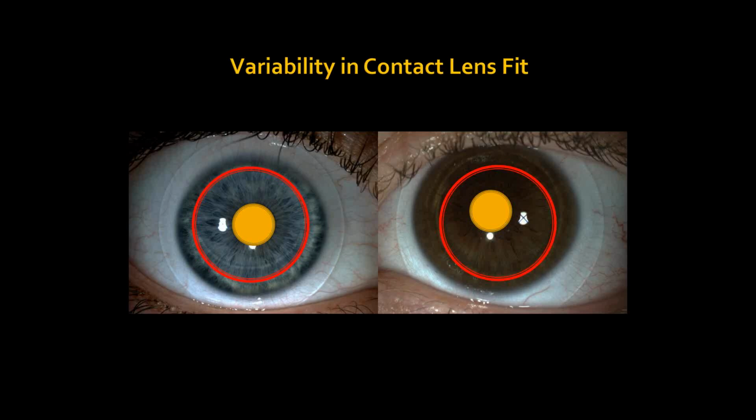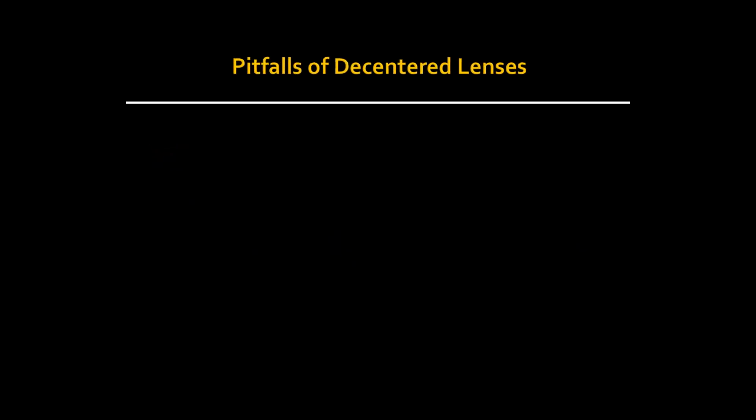So strictly based on eye size, specifically corneal diameter, which can be easily evaluated in office and is sometimes an overlooked parameter, we know it plays a role in the overall sagittal depth of the eye, and that gives us an idea of the overall ocular shape. What does this translate to? Clinically we'll see this. What does this mean now for our patient?